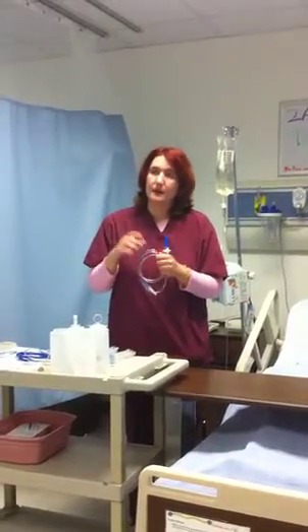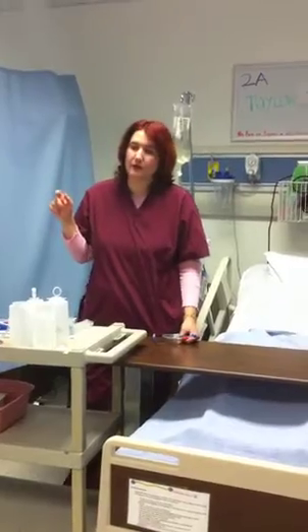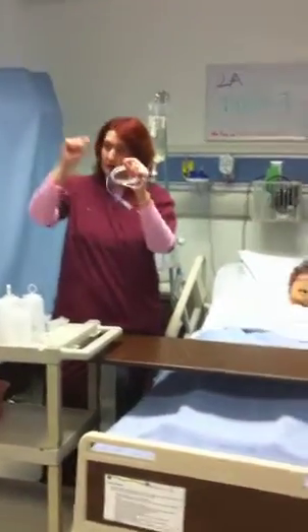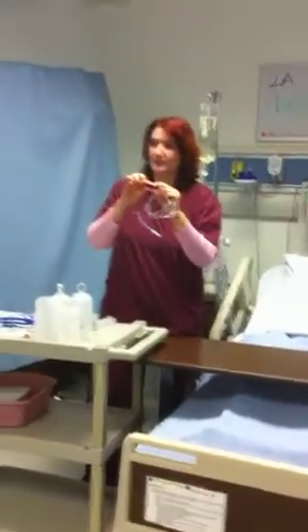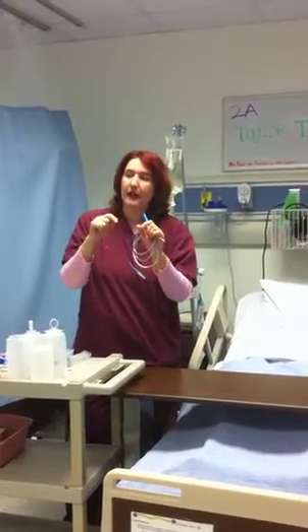There's another one that was not mentioned in the, well, it was mentioned in the video, but briefly. Excuse me. The Dobhoff, spelled D-U-B-H-O-F-F, is an opaque tubing. It's very tiny, and it comes with a stylet or a guiding wire inside, which makes it very easy to insert, but it's very tiny.